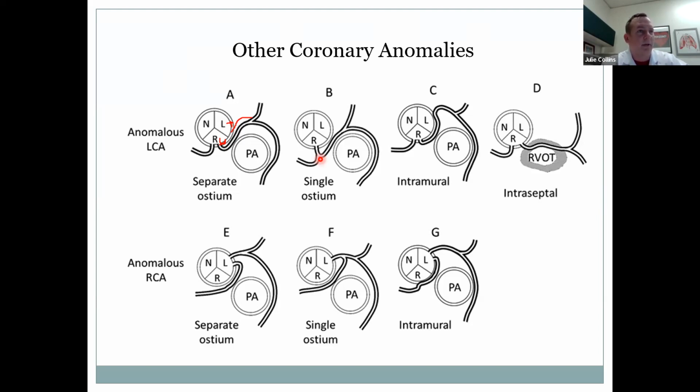That's what they were looking for, to see if blood pressure would drop and things like that. In TAVRs in general, when they deploy that valve, that can compromise coronary flow just naturally, so that's something they definitely look for, depending on where that deployment happens.